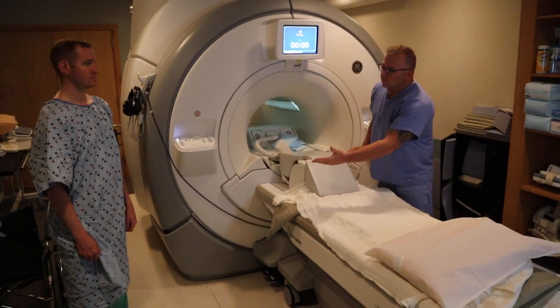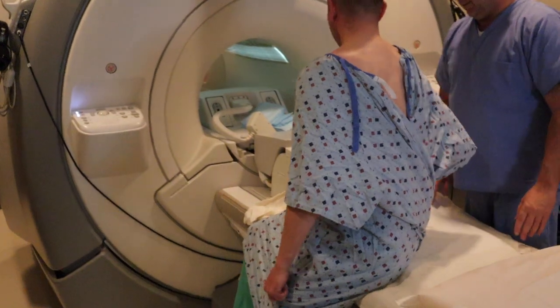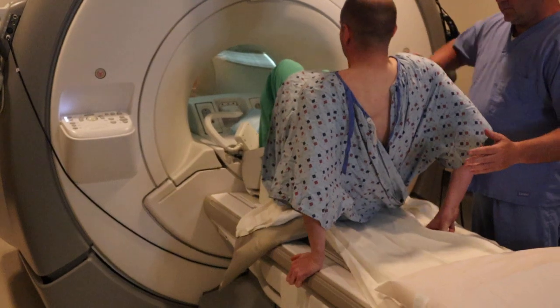You're going to take this piece of pillow and you're going to fill the spot of the cervical spine. Now, some vendors are different. This is a GE magnet that allows this to happen.